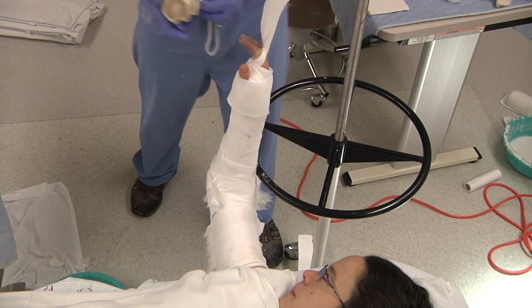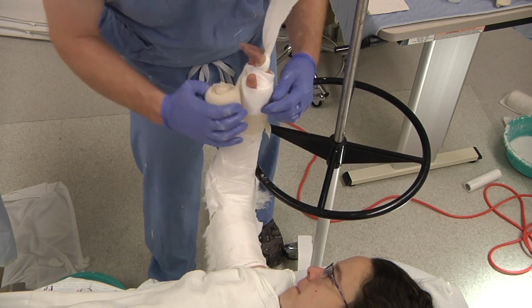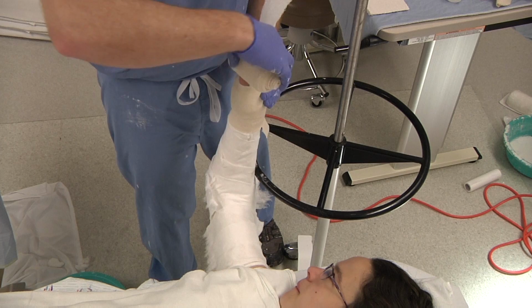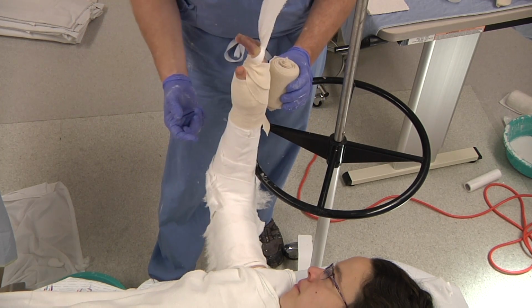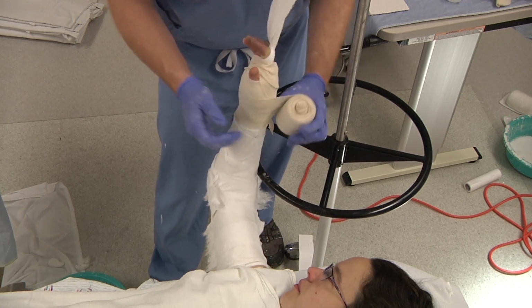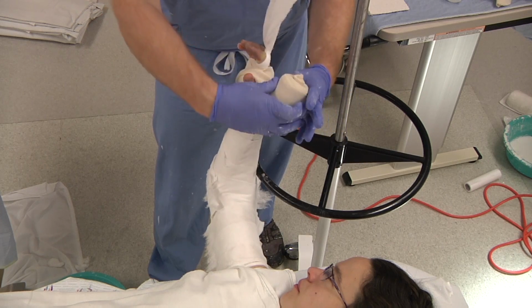Then from here, you can even wrap your bias. Generally, I'm not a fan of cutting holes in bias. I feel like that is a potential to shift, cause constriction, especially around the thumb. So it's easier to not do that.